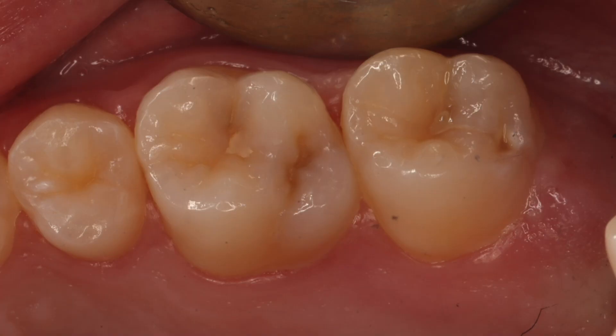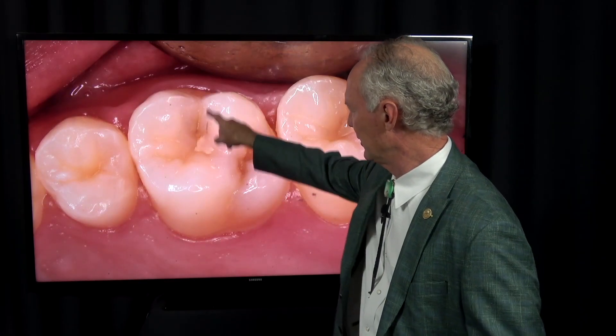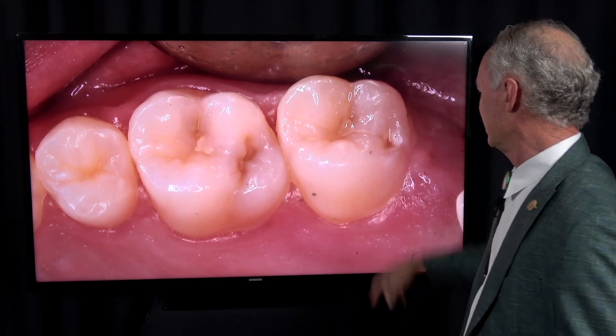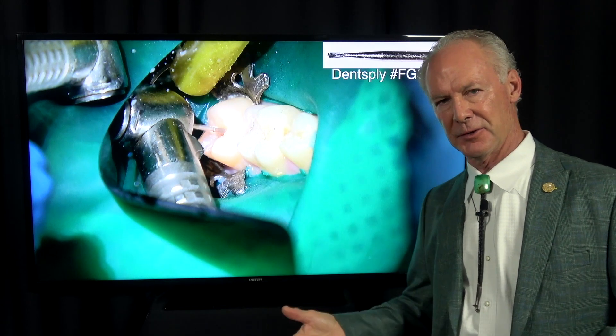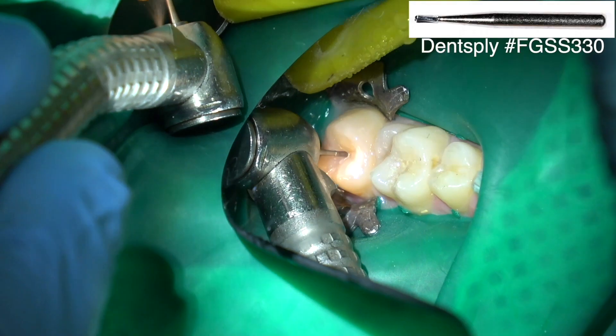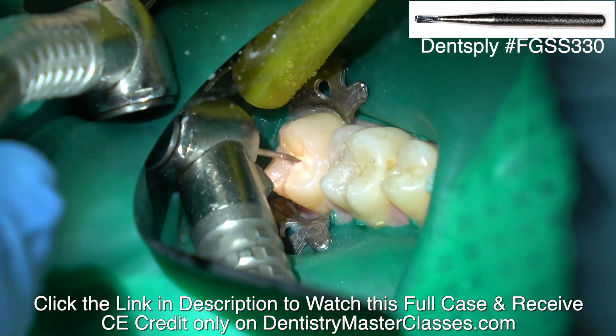So this is the upper right. You can see the decay under the sealant — the old sealants. Either there's a remnant of the old sealant or it's decayed underneath it. I routinely see sealants that have been lost, and part of it will be lost but not all of it. That's why I'm advocating placing sealants the way I'm showing you — they'll be a much longer lasting restoration.